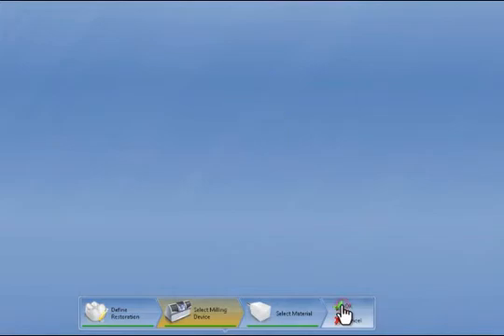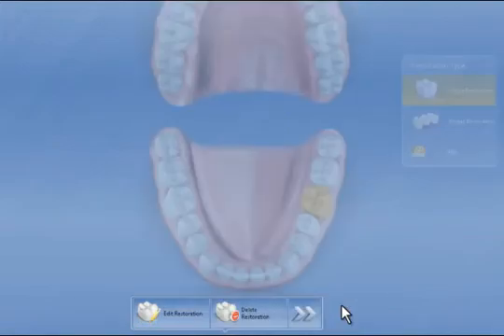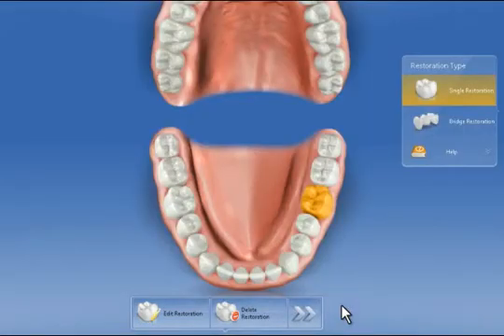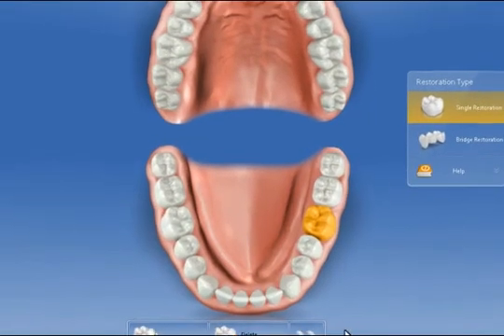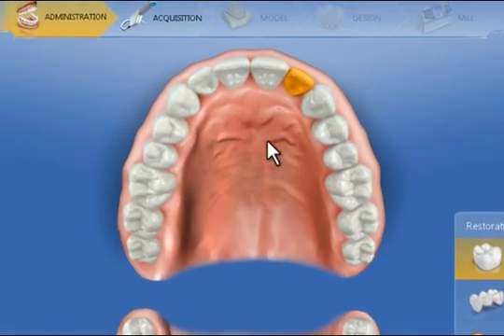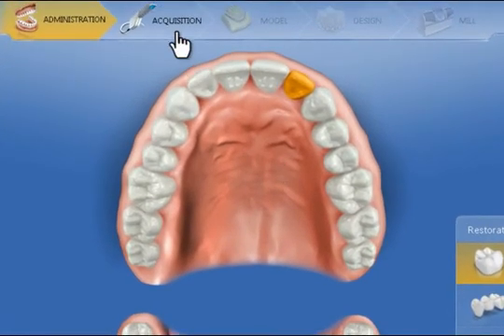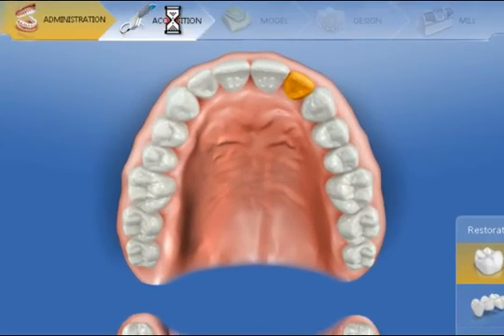The patient details and case selection are now completed. The next step would now be acquisition with intraoral image capture.